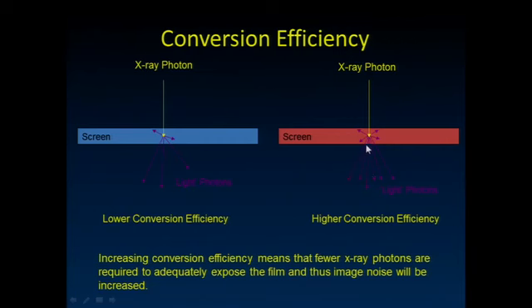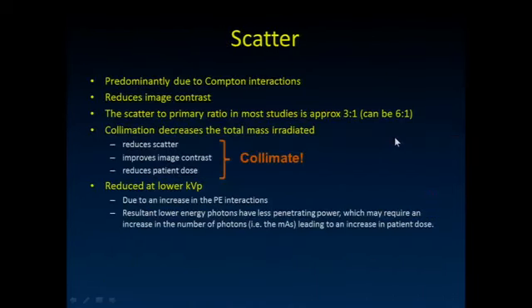Because each X-ray is going to generate more light. And so this increased conversion efficiency does result in a bit of increased noise in your imaging, because it's really the incident X-ray photons that determine how much noise was in the image, not how much light is produced. So that's the sacrifice that we pay by using different materials to stop those X-rays.